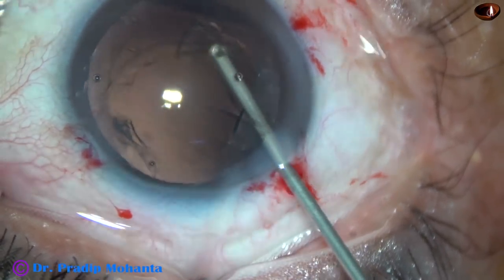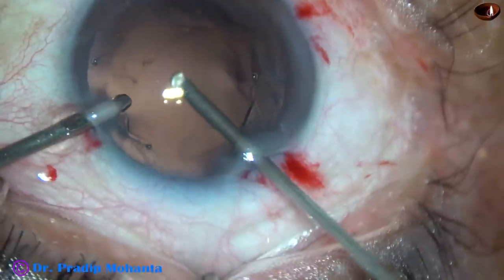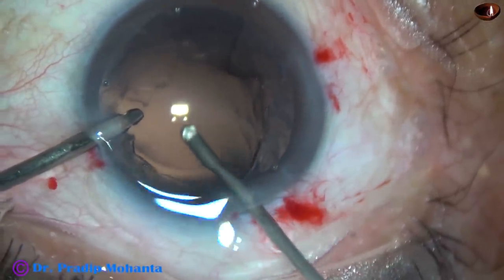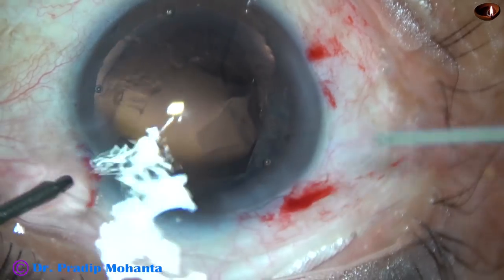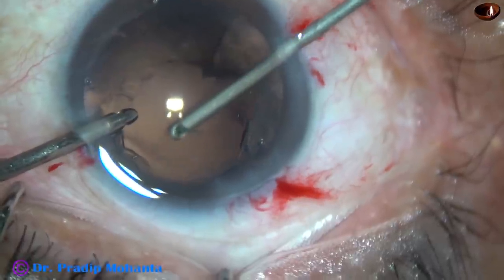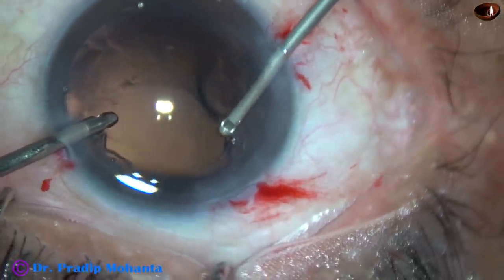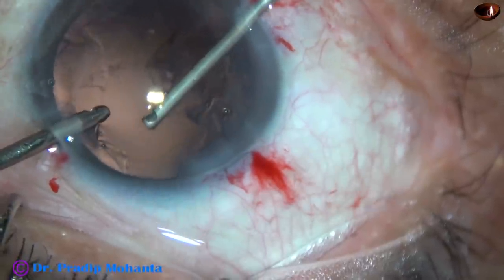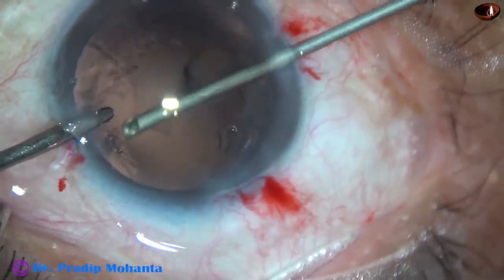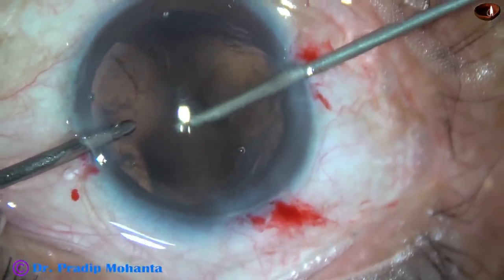Now, first without irrigation I am removing some vitreous strands. And here — this is another mistake: we should not go through the main incision as this will cause more vitreous prolapse through the main wound. There is already some prolapse. So I go through the side port and do anterior vitrectomy. I should go a little behind the posterior capsule. And here I am hooking the vitreous strands — there are a lot of vitreous strands still there at the main wound. We will see that in a short time.